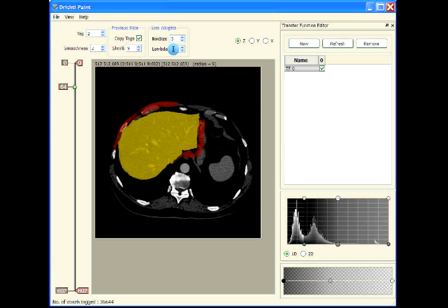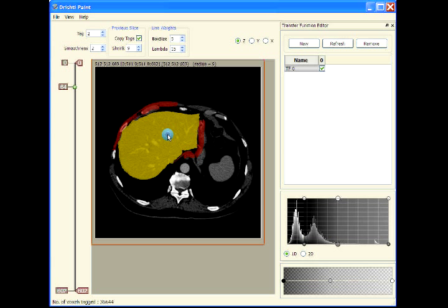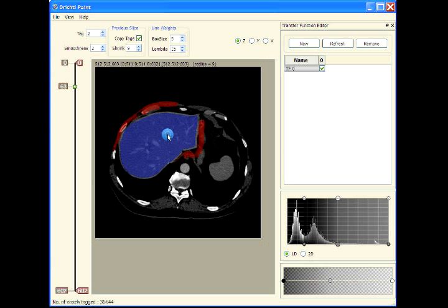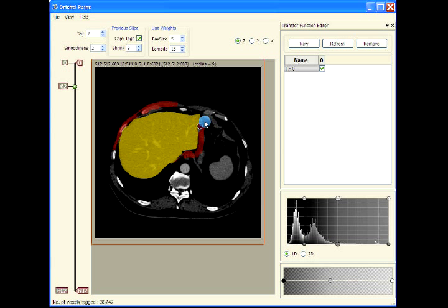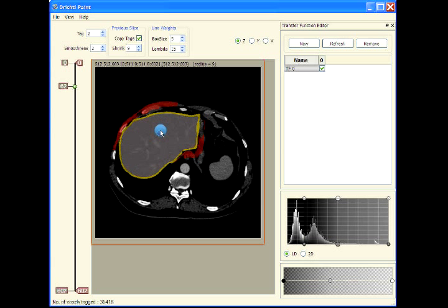Let's copy the tags, shrink a bit more, and apply. Let's increase the lambda a bit more so we get a much tighter segmentation. This is probably part of the kidney as well, but I'm not really sure I'm extending it to that region.